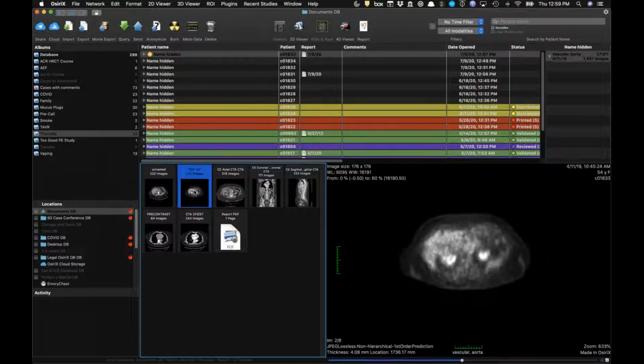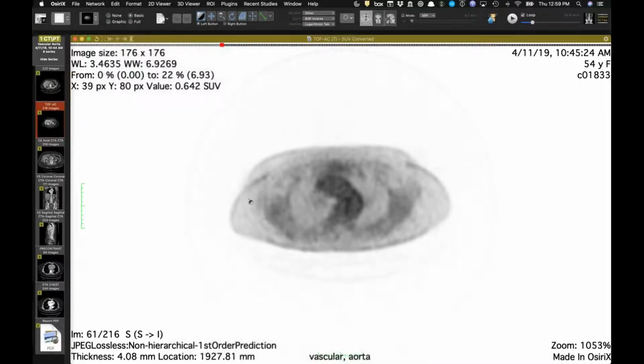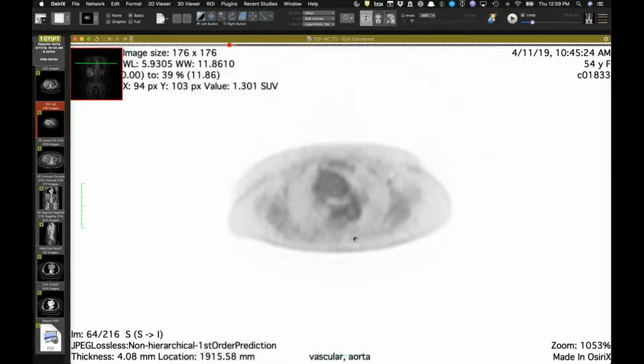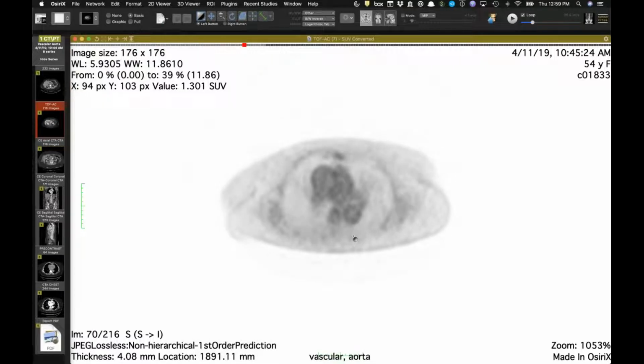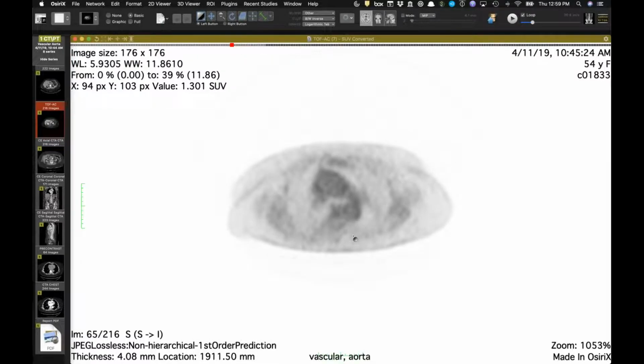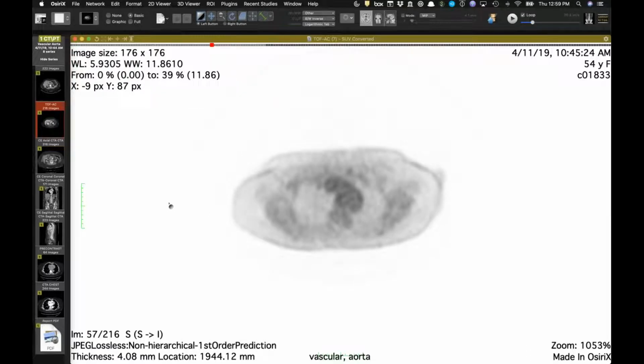She did have a PET, and you'll see on the PET that this was done around the same time. There is some activity in the wall. And she's had prior PETs where I guess there was more activity before she was put on immunosuppression. But I think regardless of the vasculitis, it is consistent with the vasculitis and that kind of segmental involvement with areas that are normal and then the wall thickening.